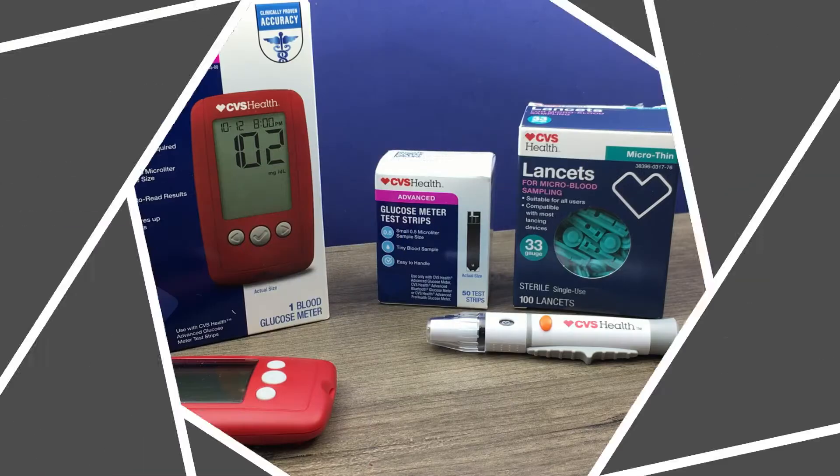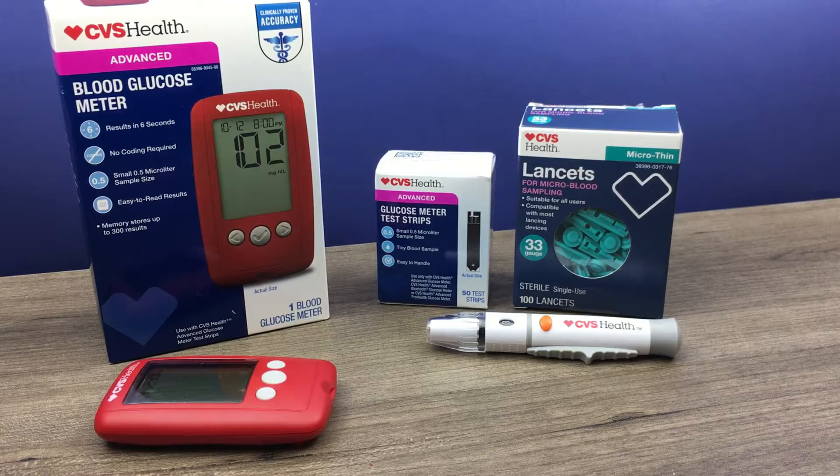Hi, this is Josh, pharmacist with Learn Blood Sugar Testing. I'm going to take a look at how to perform a blood sugar test with the CVS Health Advanced Blood Glucose Meter.